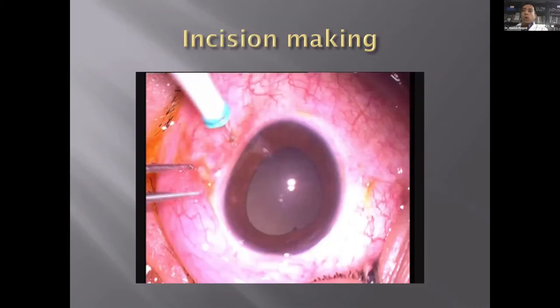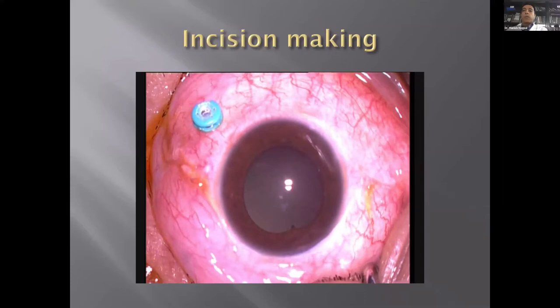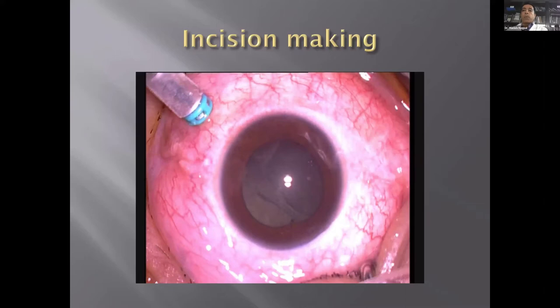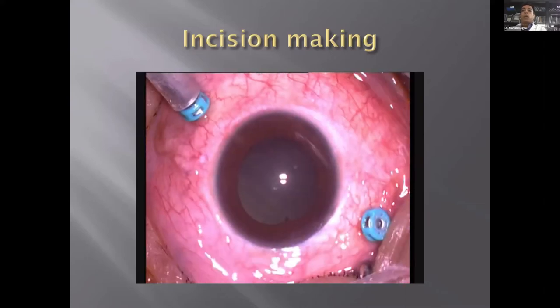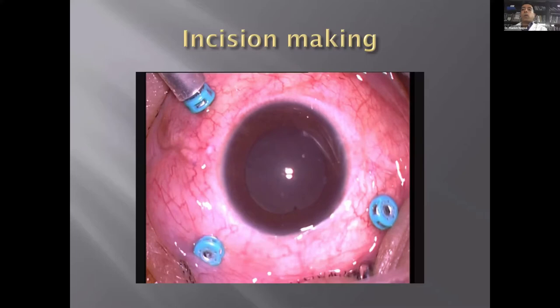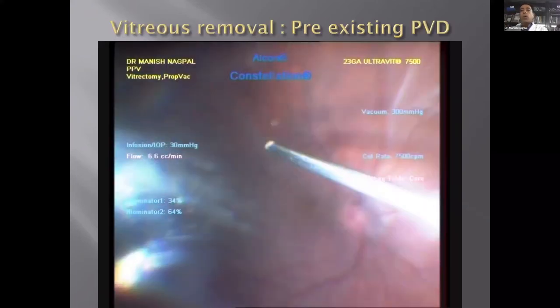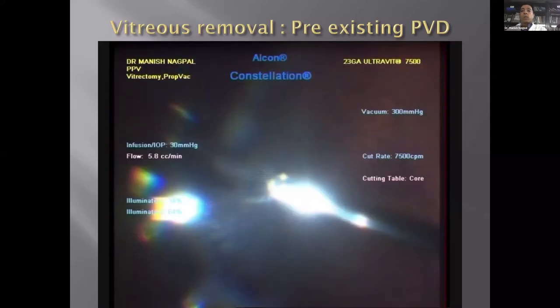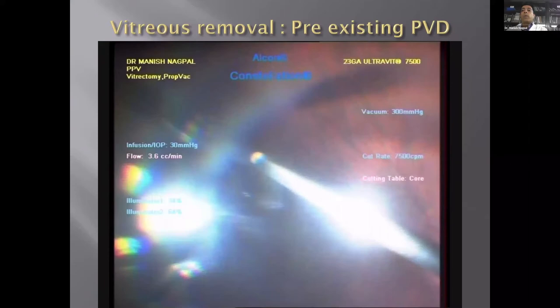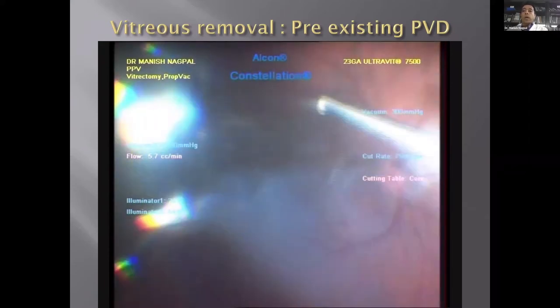Let's go on to primary vitrectomy for a classic detachment. We start with the incision — typically nowadays we use a 25-gauge or 23-gauge MIVS-based approach. We put in all three cannulas, then start the surgery. The most important part is to remove the vitreous — once you have a good view, you do a core vitrectomy and remove it as far as possible.